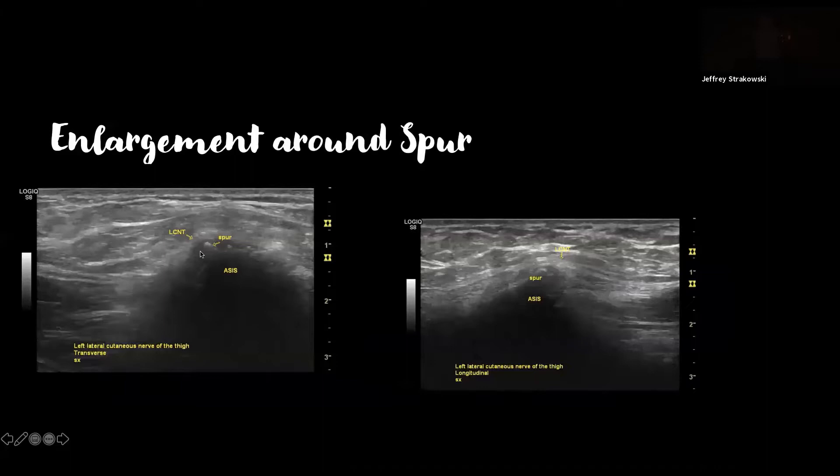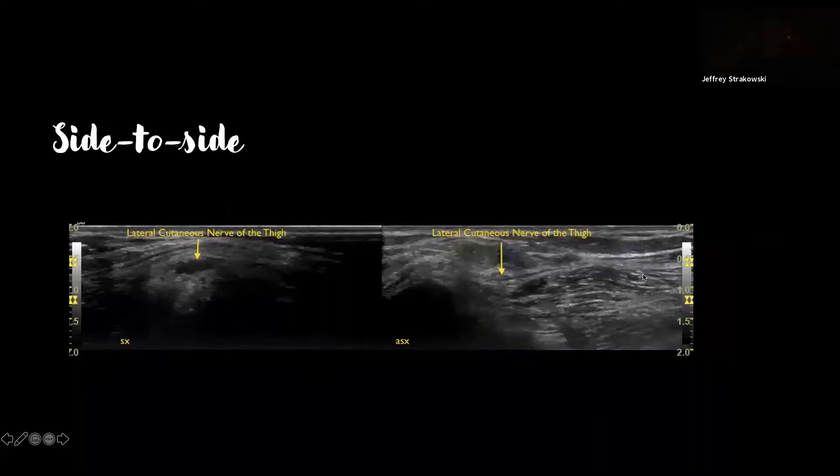Here's an enlargement of the nerve right around a bony spur. A spur or osteophytic spur can develop from the origin of the sartorius, and sometimes the nerve moves right across the spur. This is a cook who often leaned against a table and was getting symptoms from that. Here's a longitudinal view — the nerve is focally enlarged right at the level of the spur. It's always good to do side-to-side comparison so you can compare a normal area if you're not used to looking at that nerve.